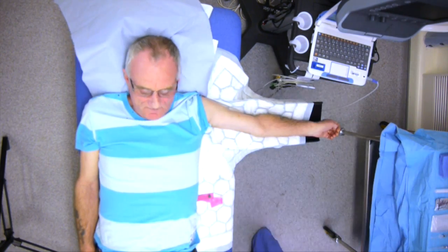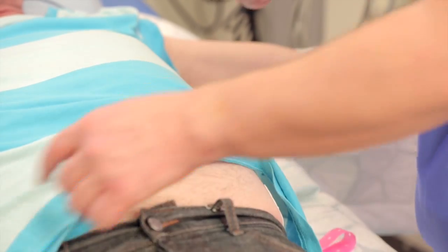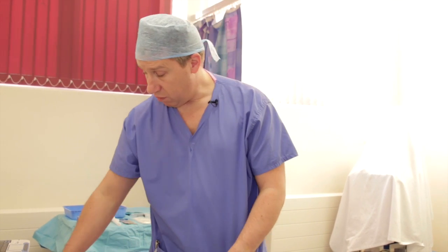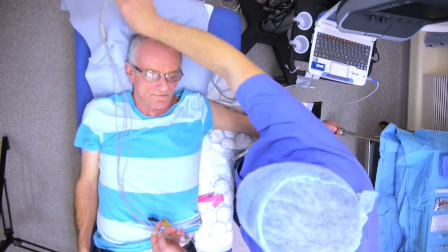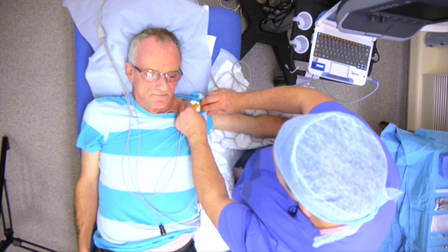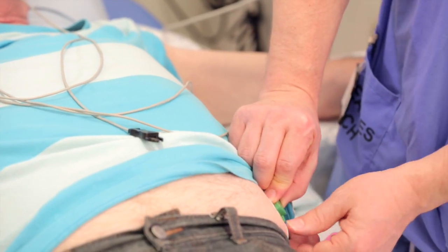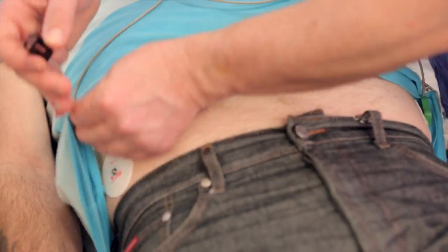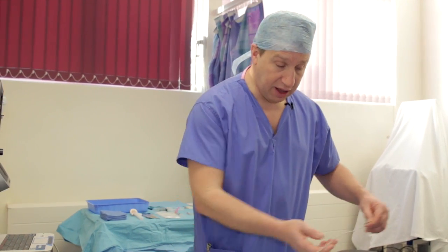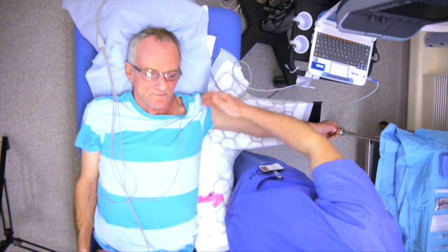We're connecting the Nautilus to the patient now by placing sticky dots on the chest. It's really important that the ECG dots are fresh so they make good contact. We have three patient leads connected: the yellow lead on the left shoulder, the green lead on the left hip or lower abdomen, and the black lead on the right lower abdomen or hip. It's really important that these dots are as far apart as possible to give the best ECG trace.